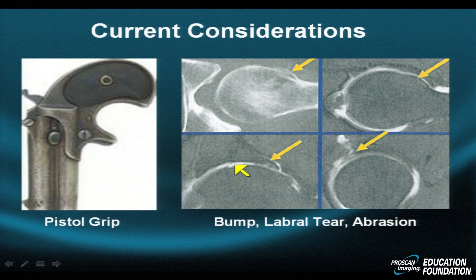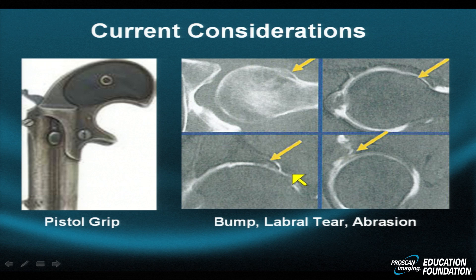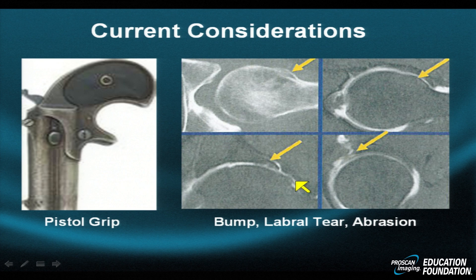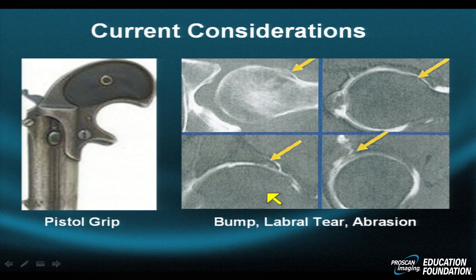Chondromalacia has ensued. A small bump is present in the coronal projection, and a sagittal view demonstrates a longitudinal tear with diffuse swelling. The abnormal signal and loss of hyaline cartilage at the tip is known as a hyaline cartilaginous abrasion.